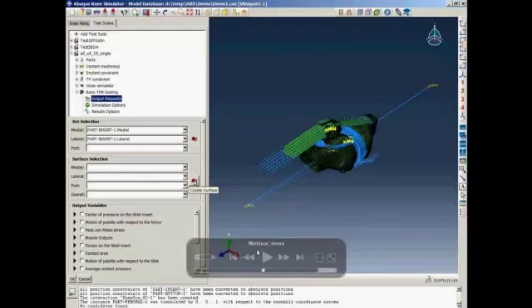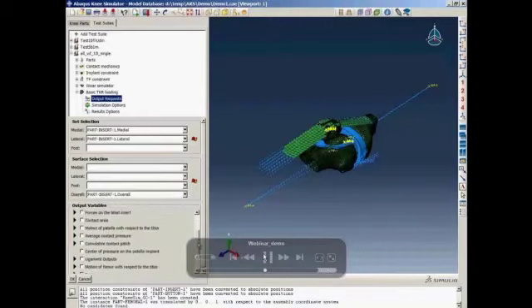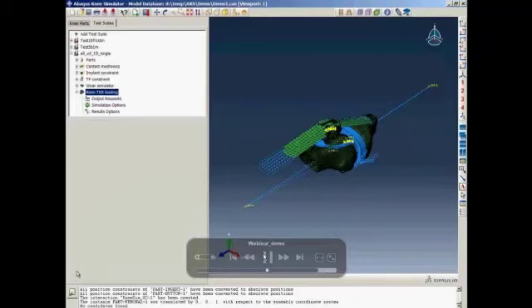And also, they can create surfaces on the fly. As I mentioned, these surfaces and sets are only available for the specific workflow where they were created, while for these sets and surfaces created at the parts level, they will be accessible for all workflows. There are various output variables provided for each workflow. For more complex workflow, there will be muscle output, ligament output, and contact output, while for the simpler workflows, there will be mostly contact outputs and force constraint type of output instead. And for some outputs, there are options to choose output to different sets and surfaces.